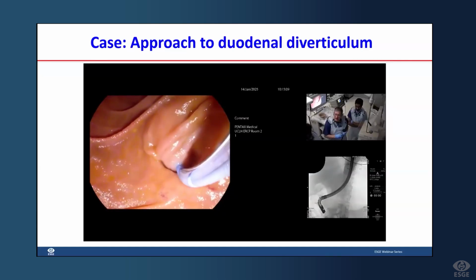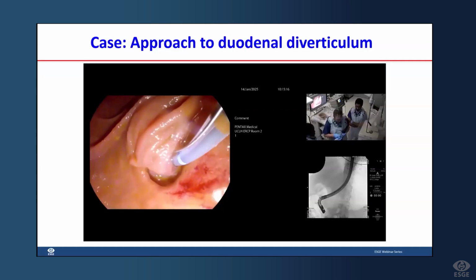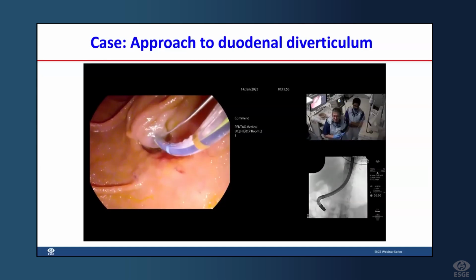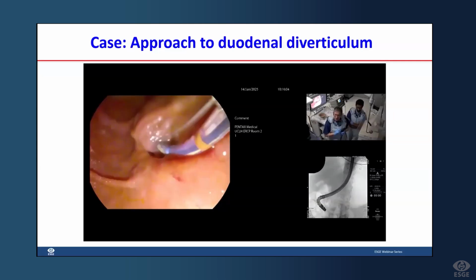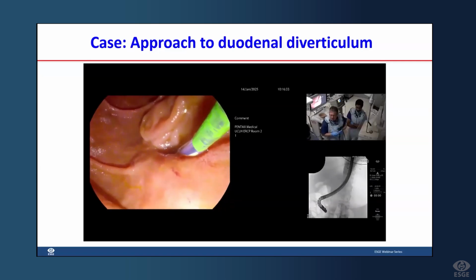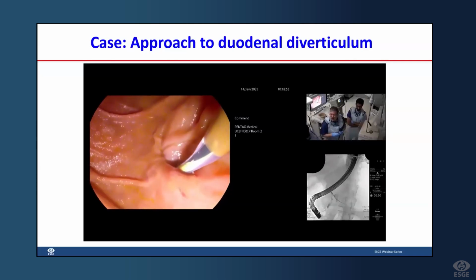Strip the wire, please. Okay. So we're in there. So maybe we're going to be okay here. It's really in the direction of the pancreatic duct, but that doesn't bother me here. Screen, please. Right. Now, I here am going to put in a pancreatic stent, and I'll show you why I want to do that. Just inject a little bit of contrast there, please. Screen. Stop.